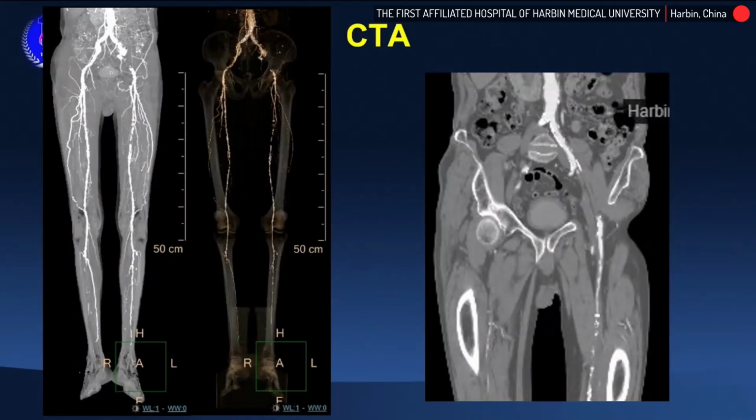Next, please. And these are his CTA before operation. We can see the disease is mainly focused on the left external iliac artery, right? And also there's some disease on the SFA. But the collaterals are quite good. And if we zoom in, we can see a lot of calcifications in the iliac artery, and also some calcification for the SFA.